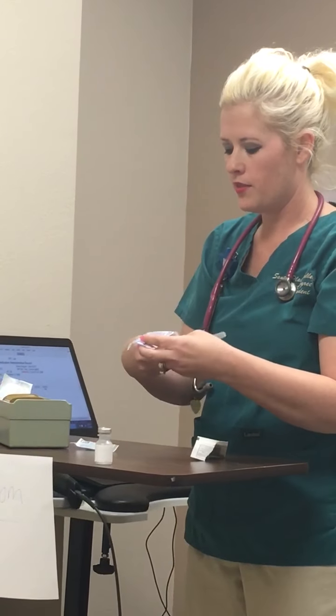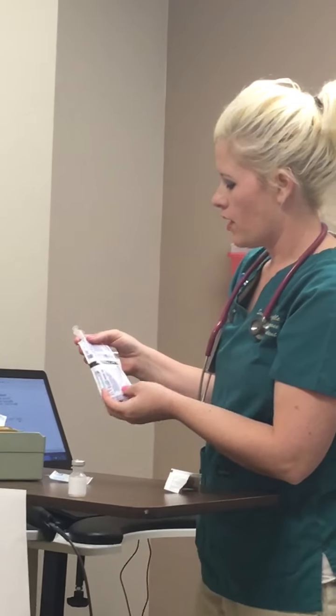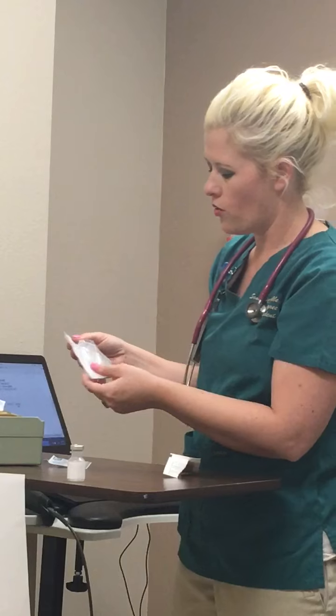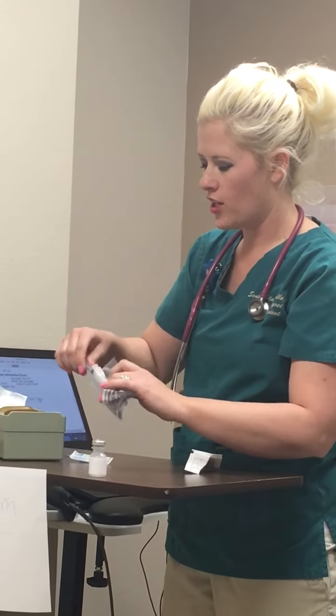Before I open this package, okay, so I'm going to open this package. Before I do, I'm going to go ahead and check the expiration date. I'm going to note that it is intact. It is not open. Okay, I'm going to open it. I'm going to attach my syringe.